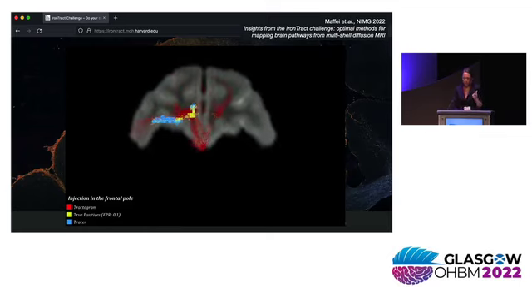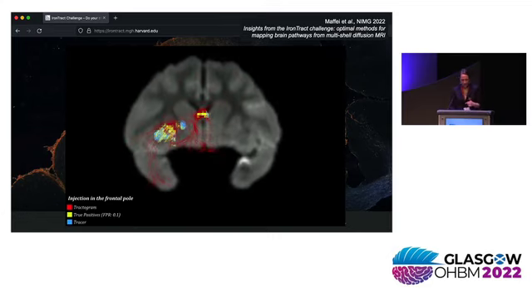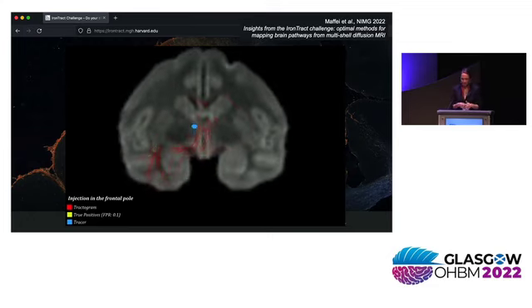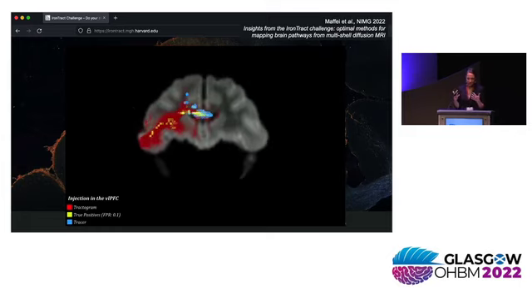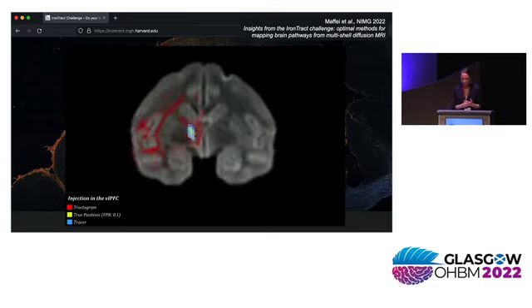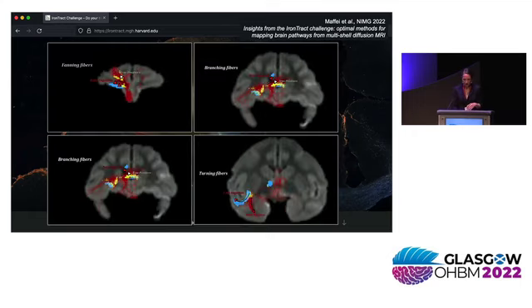Then there's going to be a branch point between the cingulum bundle and the corpus callosum, where tractography gets only the latter. Then a branch point between the internal capsule and the external capsule. Tractography gets only the former. And this sharp turn in the uncinate. And here comes the VLPFC injection. We'll see very similar patterns, that cingulum and corpus callosum branching. And then another branch point with thalamic versus brainstem fibers. So usually tractography follows only one of these paths and not the other. And here are those trouble spots.